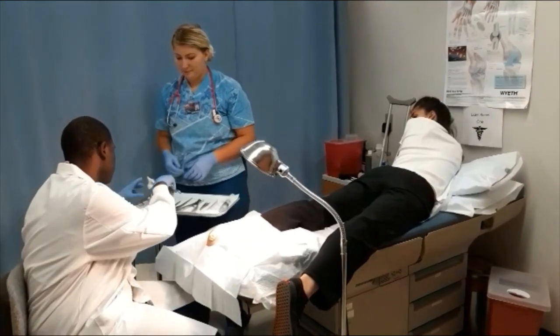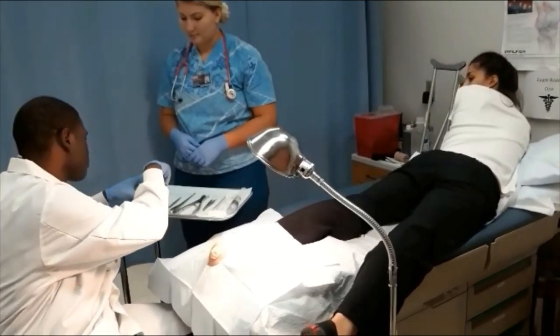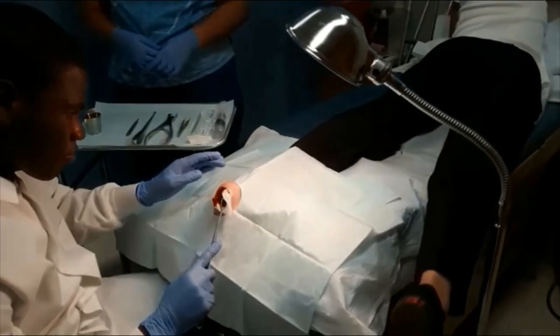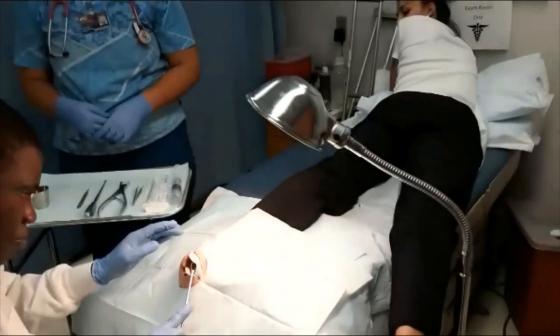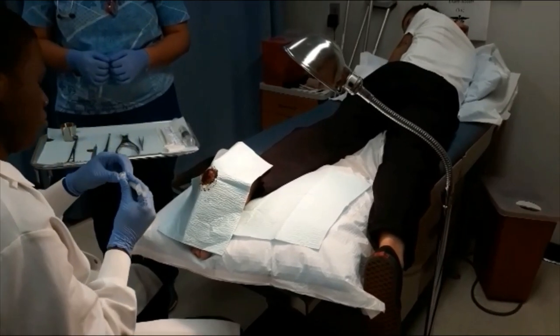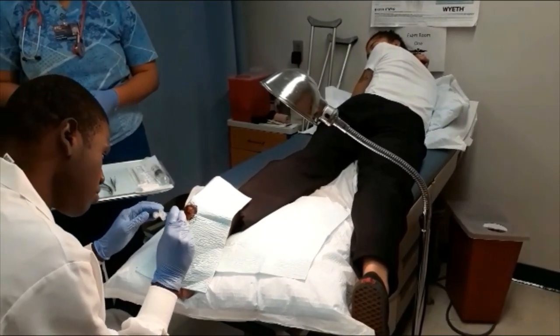The physician will begin by cleaning the wart and surrounding area with betadine, a topical antiseptic. Then inject xylocaine, a local anesthetic, into the surrounding tissues to numb the area prior to the procedure.